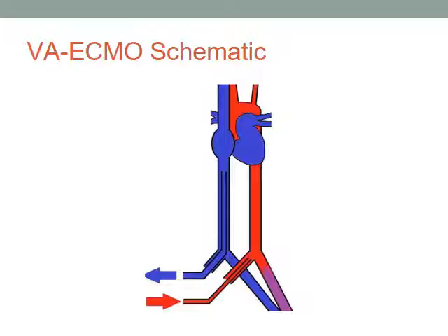meaning red blood that's going up the aorta. And you run into the possibility that you actually have blue blood going to the patient's brain and red blood going to the lower part of the body. And we've seen this many times, and we'll talk more about that. I'm just going to hit some of these things over and over again, because this gets phenomenally complicated, hard to get your head around sometimes.